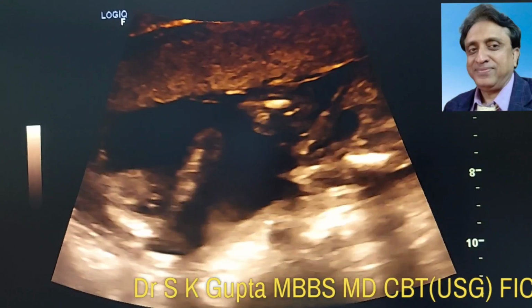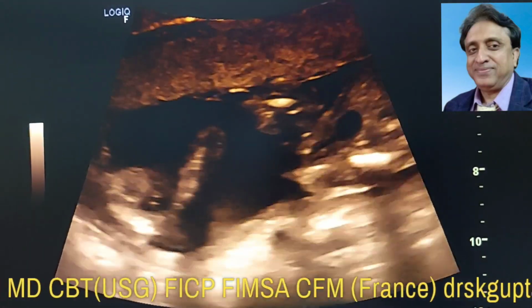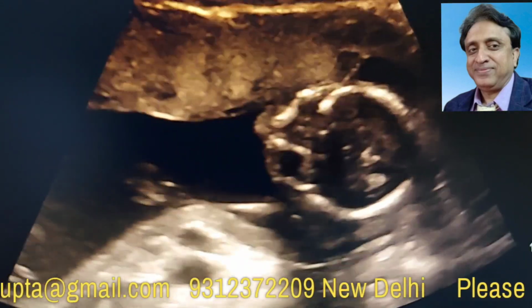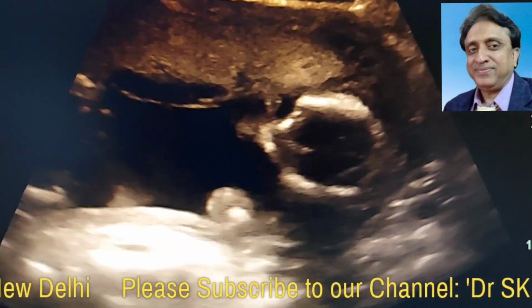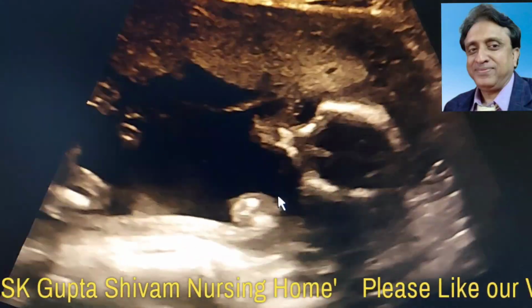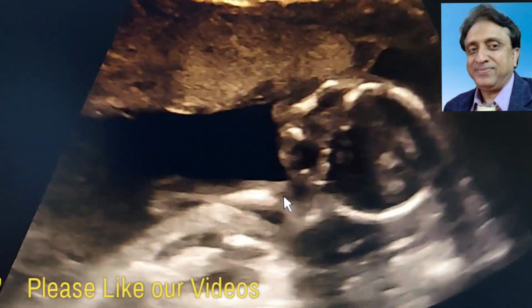These are both the lower limbs, and you can see and appreciate the active movements of the lower limbs. This is the triple vessel cord. This is the coronal section of the face, and you can see both the orbits, upper limbs, and the other facial structure which appear to be symmetrical. And from here it appears that the bones will be normal, but once we tilt the probe, we find in the occipital region that there is occipital encephalocele.